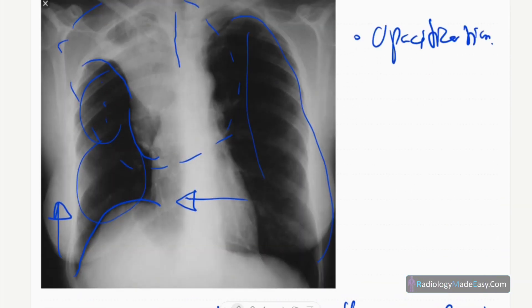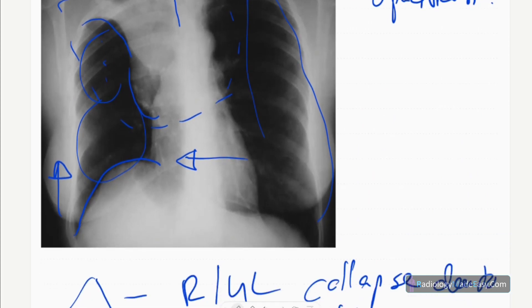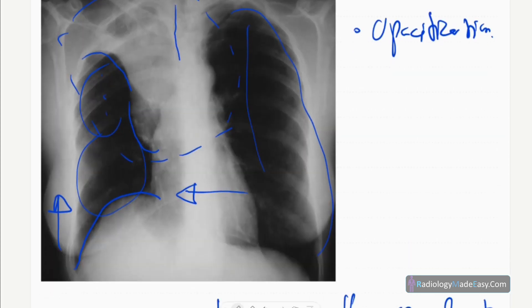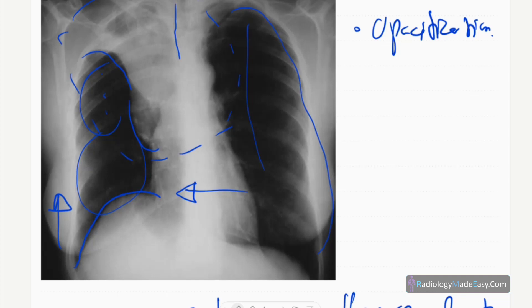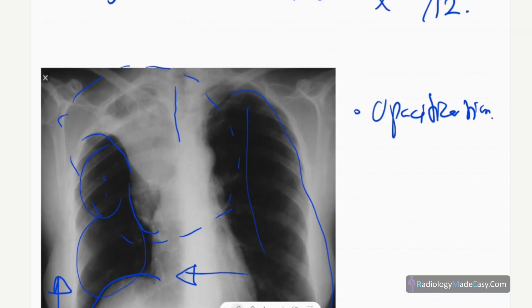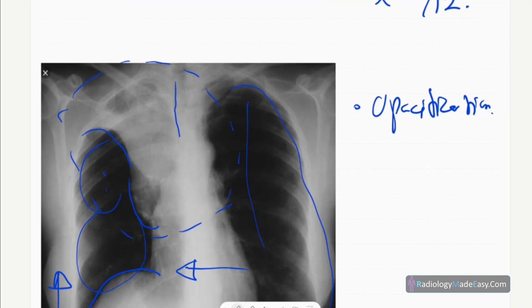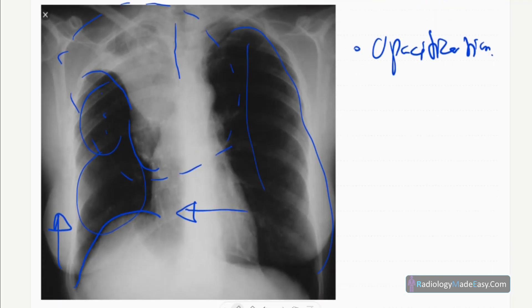In right middle lobe collapse there is also volume loss and blurring or obscuration of the right heart border. In lower lobe collapses, both right or left lower lobe, the flat waist sign can be seen. In left upper lobe collapse there will be a veil-like opacification and the Luftsichel sign.